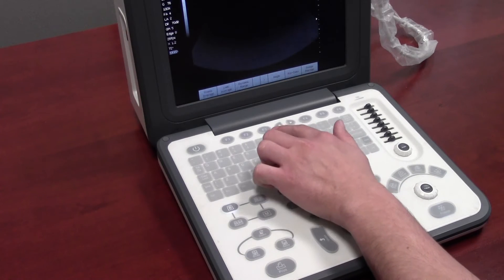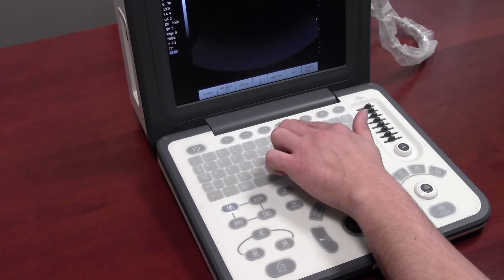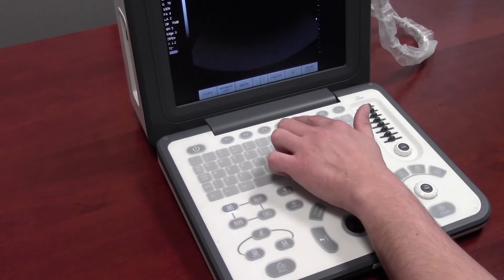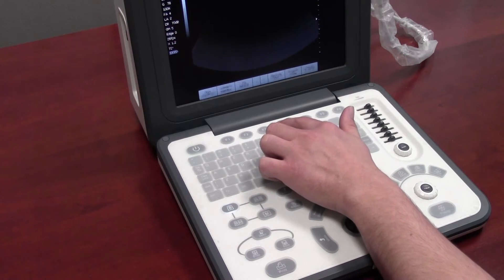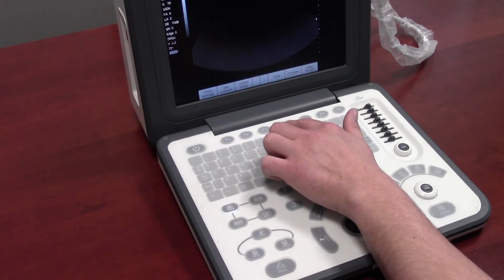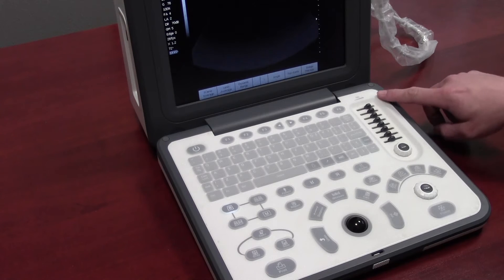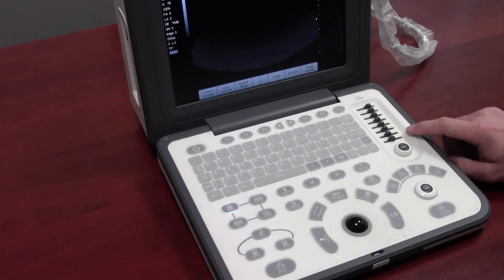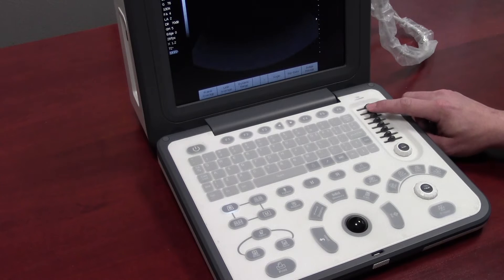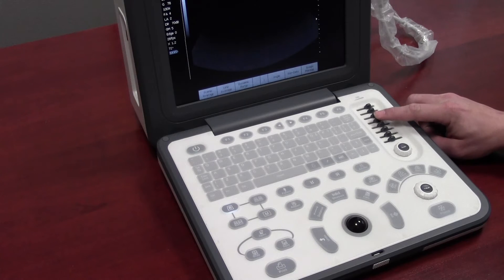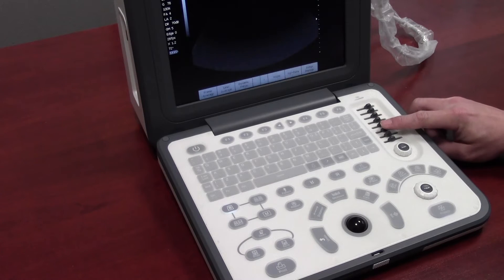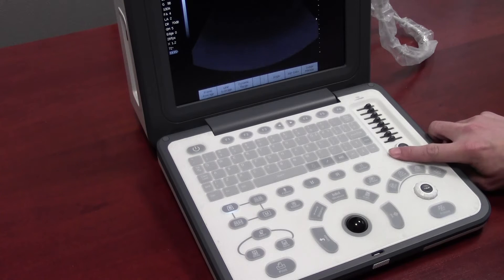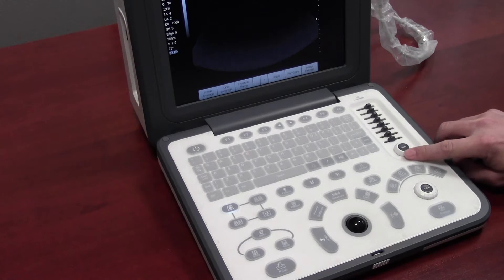You can use the left and right arrow keys to browse through the B-mode parameters and make changes as needed. To the right are the TGC slides — you can adjust each individual slide to adjust the gain in that particular area, or use the auto gain encoder to adjust the overall gain.